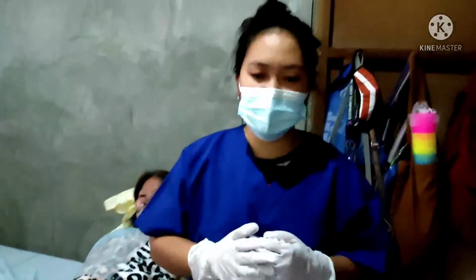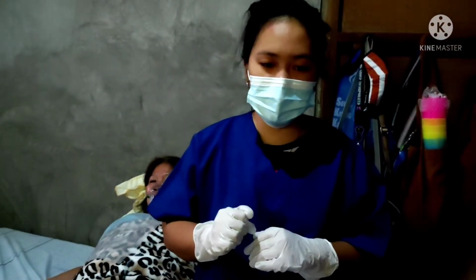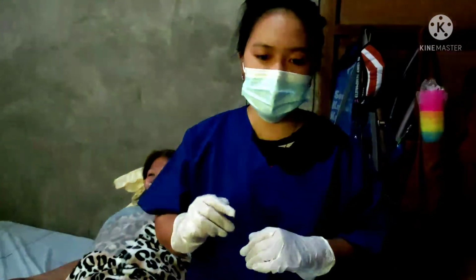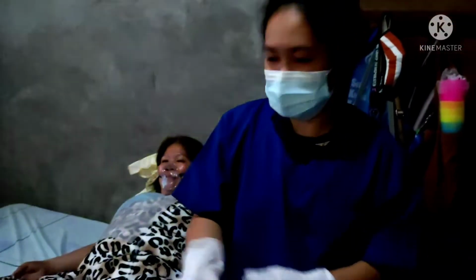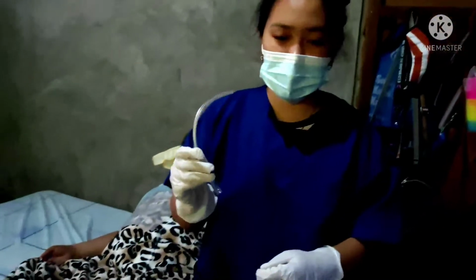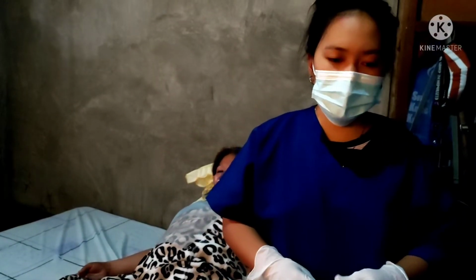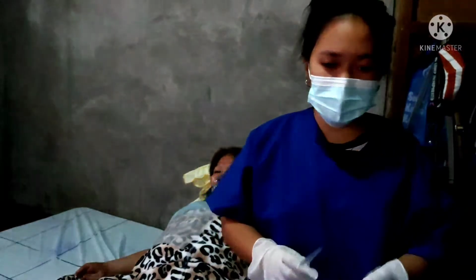Use your dominant hand to pick up the suction catheter without touching any non-sterile surface. So let's assume that this is our suction catheter. Touch the catheter to the tubing to make sure the equipment works properly.